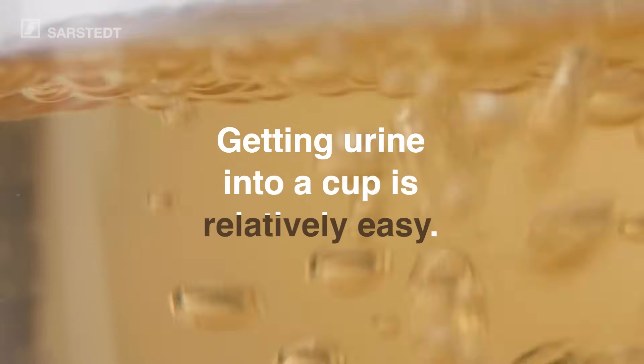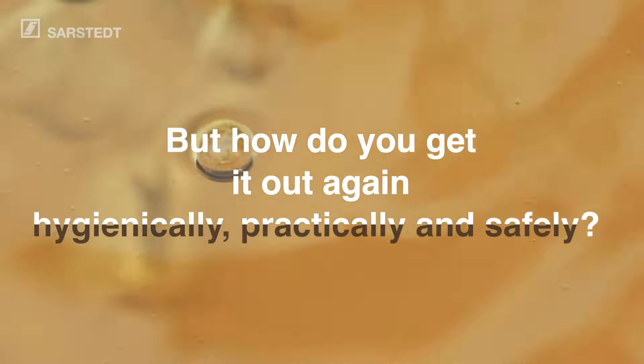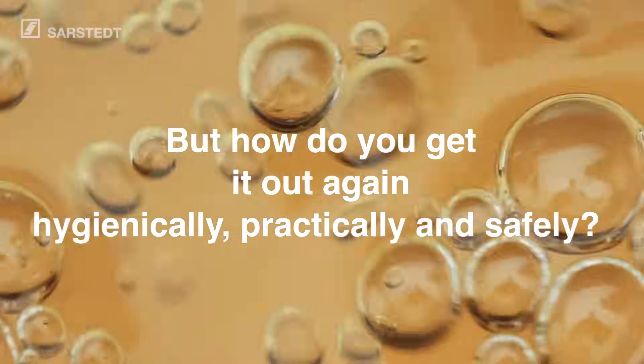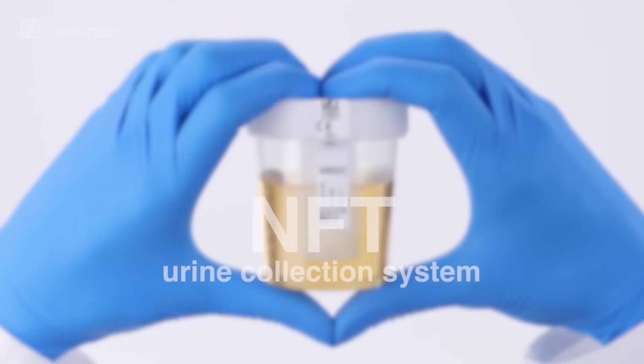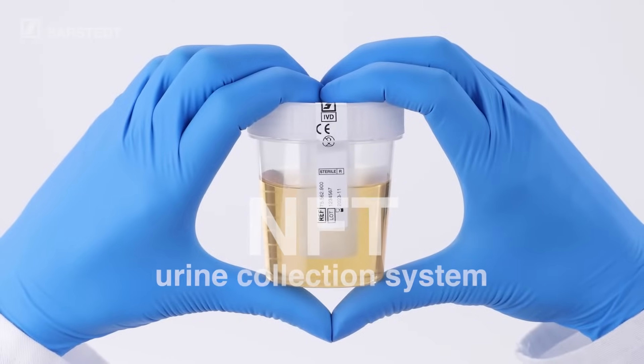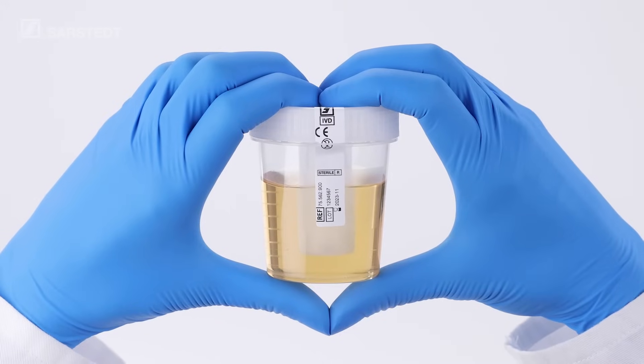Getting urine into a cup is relatively easy. But how do you get it out again? Hygienically, practically and safely? A new solution now makes this easy too. The NFT Urine Collection System — Sarsted's first collection system with hygienically enclosed and needle-free sample collection.